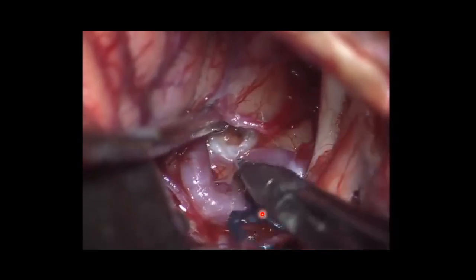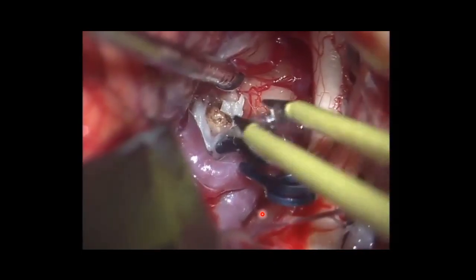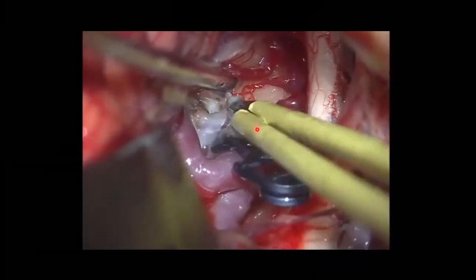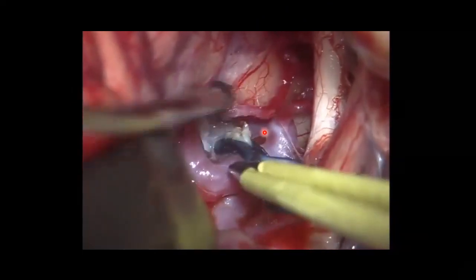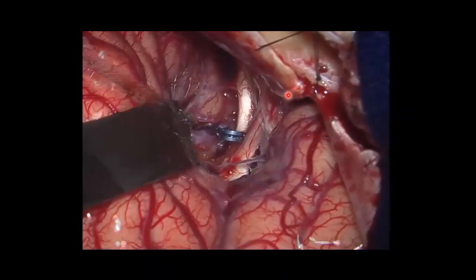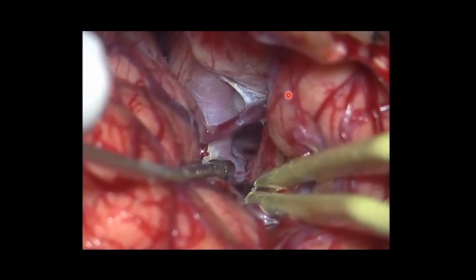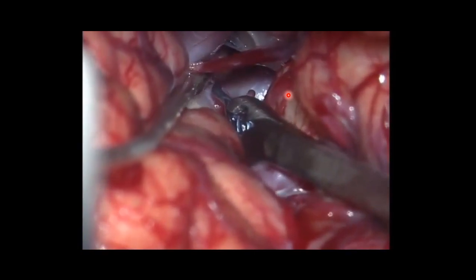Now he's trying to separate the aneurysm sac from the left A2. This is left A2. Now the aneurysm sac is left here. So this is a final aspect after the clipping of the aneurysm of the ACom. And this patient has another aneurysm located at the anterior choroidal artery. Anterior choroidal artery. See the aneurysm?